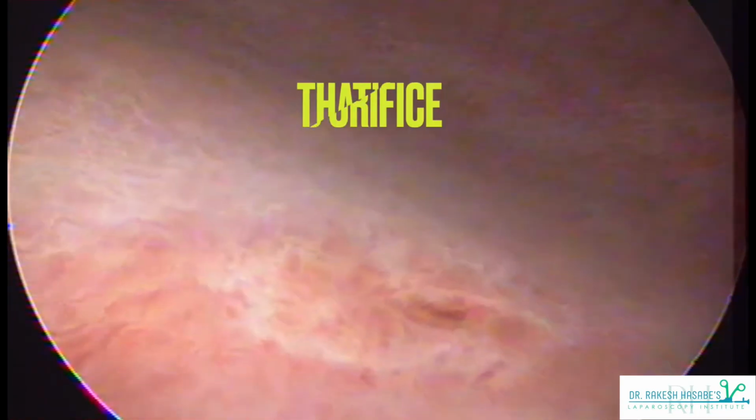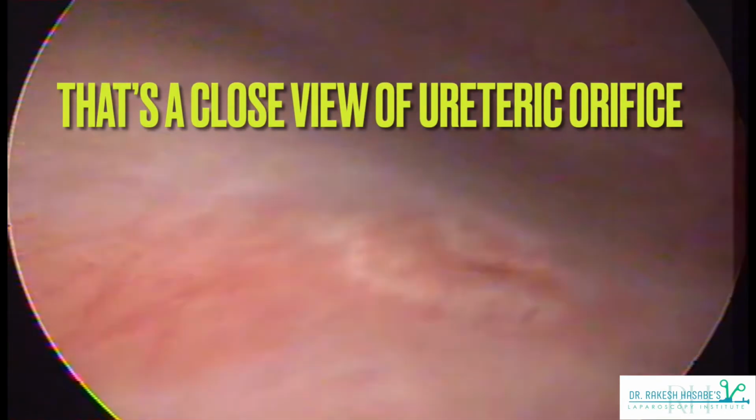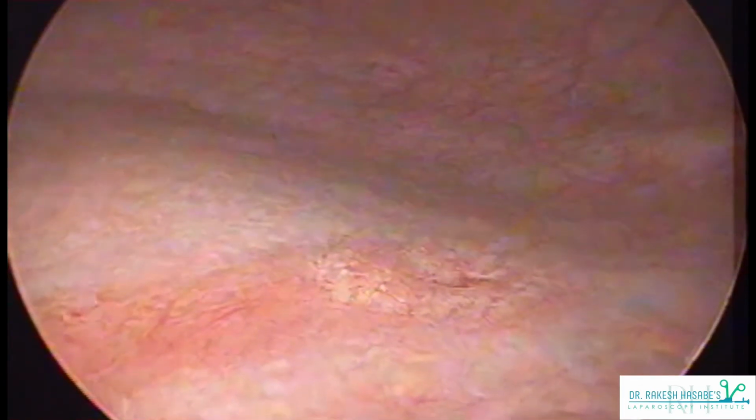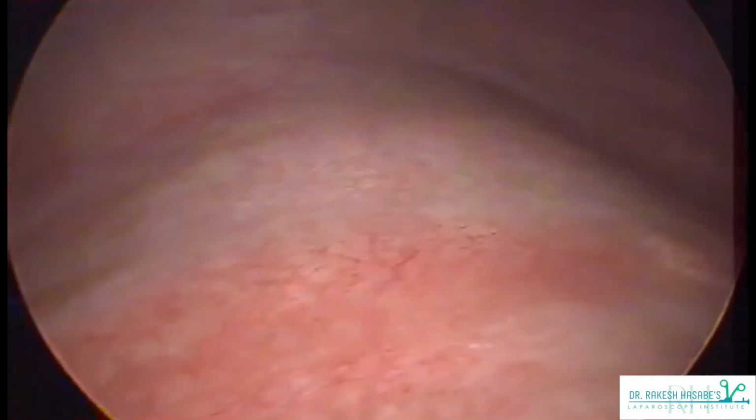So again, as you can see on the screen, I am focusing on the left ureteric orifice. Let's have an even closer view of the left ureteric orifice. I'll try to focus on it or give a close view of it as much as possible.